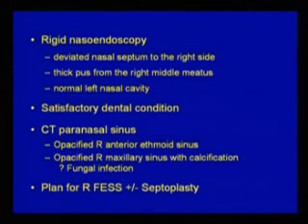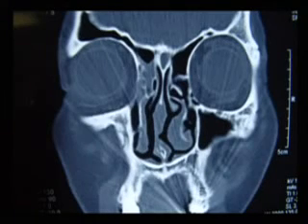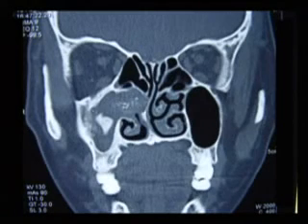I would like to show you two cuts of the CT, but Dr. Sham is going to show you more detail. As you can see, this patient has unilateral disease. The anterior ethmoid is opacified. The frontal recess is clear. The other side is normal. A cut further back, you can see the maxillary sinus on the right side is completely obstructed by a mass which also essentially fills up the middle meatus. If you look more carefully inside the sinus, there's heterogeneity of the tissue contents. Perhaps this can be a case of fungal sinusitis. Maybe without further ado, I would pass the presentation to Dr. Sham now.